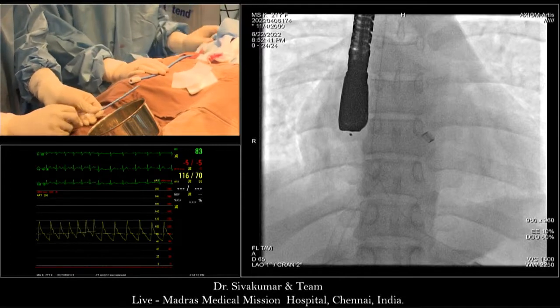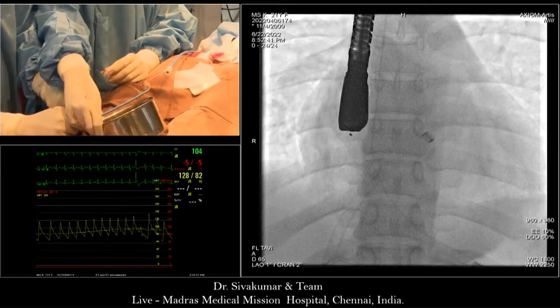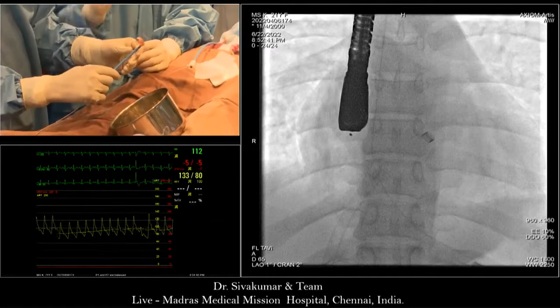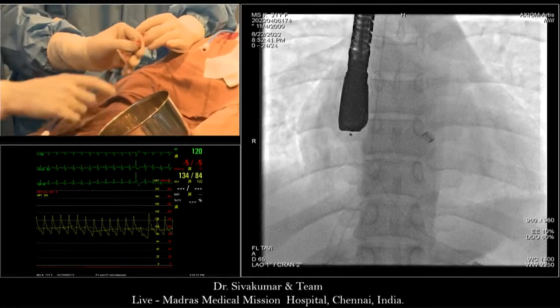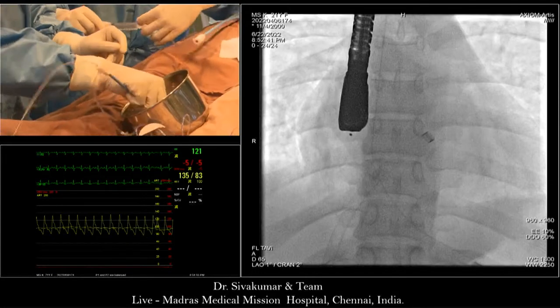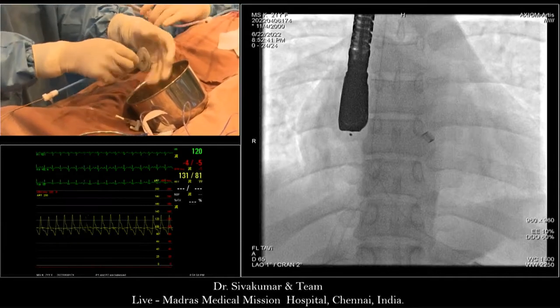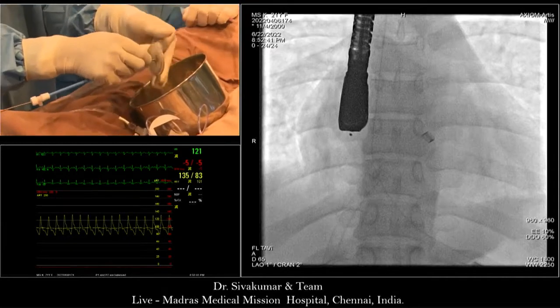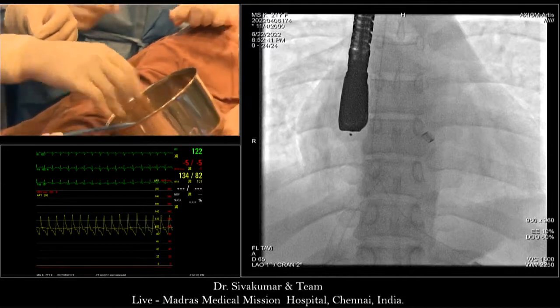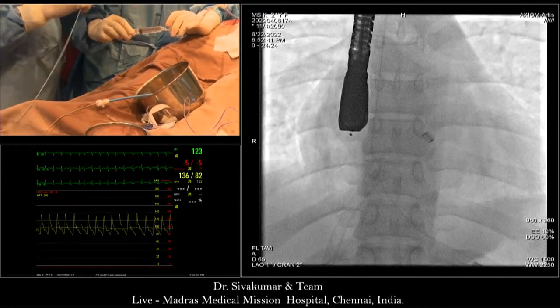You might have a 38 device available. No, but I feel the 40 is correct. You see that the Cobra is there. For those who've never seen the Cobra, there it is, a very good example of the Cobra. Just ask them to show that last image and show it again whilst you're getting rid of the Cobra.